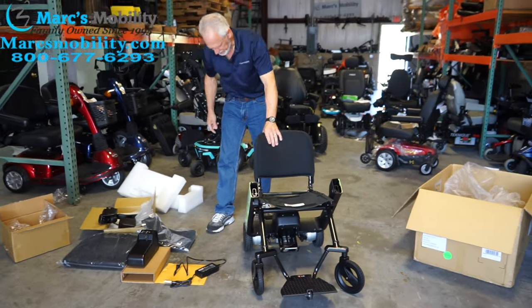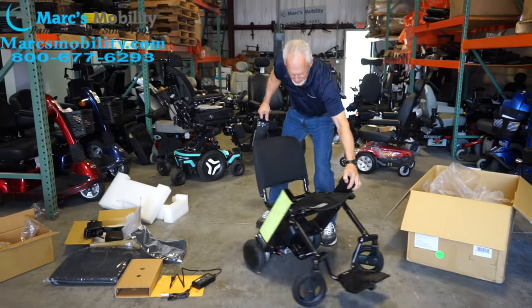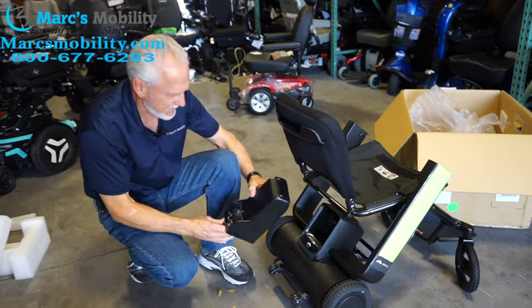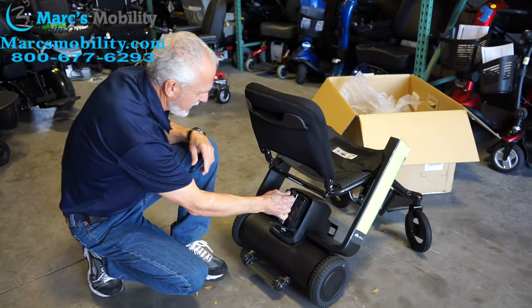Now what we're going to do is drop the battery pack in the chair. If you can see in the back, the battery pack will drop right here. You can see it's pretty simple. Drop your battery pack — your battery pack is in the chair.